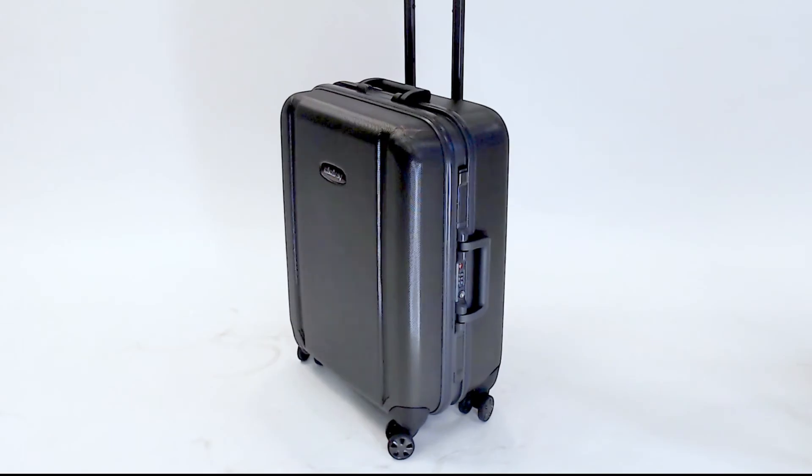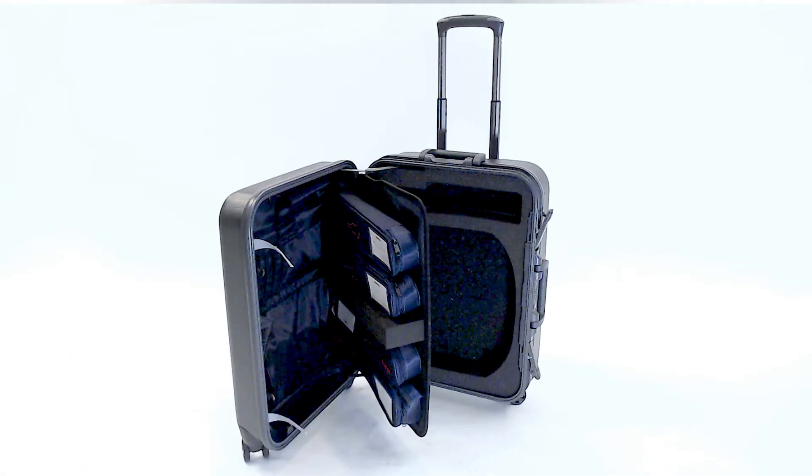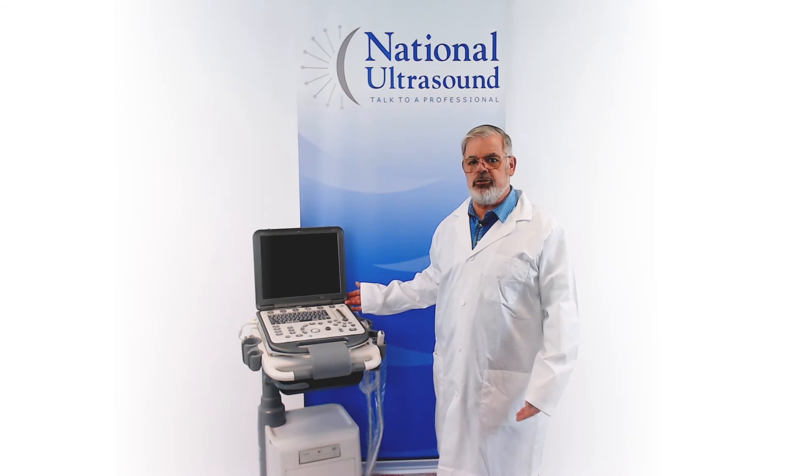The M6VET comes with a convenient durable rolling travel case that can hold up to four probes. The M6VET is a versatile solution for abdominal, cardiovascular, large animal repro, and tendon imaging.